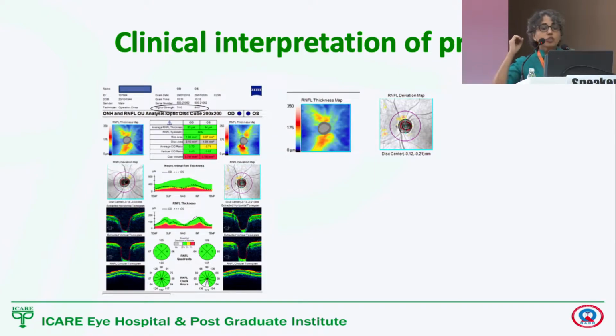That should not be the only criteria, because there can be normal patients who might be outside the normal range of what is in the data, or there might be abnormal patients who will fit into the normalcy. So the red, yellow, green can help you a little bit and also help you make the patient understand some things, but it is not the key to look at.